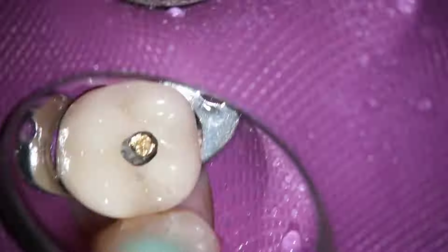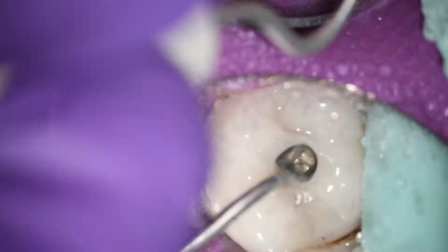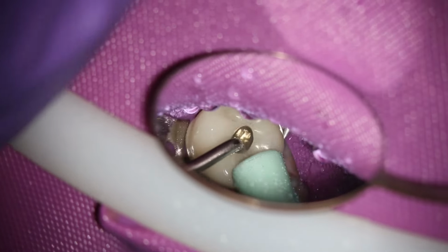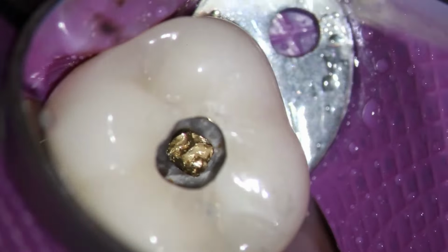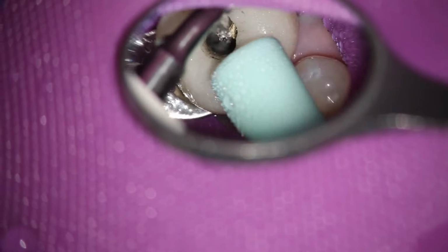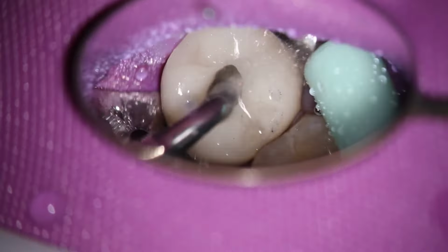I've speeded this up so that you get a better sense of the movement of the mirror. And as you can see, the mirror is not getting dirtied by the ultrasonic. It's down near the bottom of the rubber dam frame. And we just go through the procedure for removing the post with the ultrasonic. We take all the composite resin around the post, and then we just vibrate out the post with a scaler tip. Again, just removing some of the cement around the post. And then vibrating the post out.